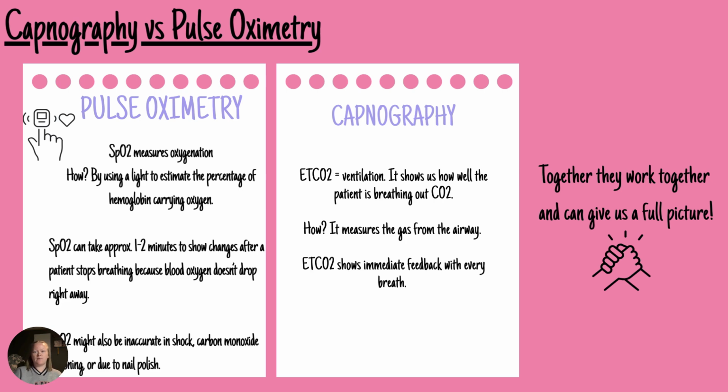So it shows us how well that patient is breathing that CO2 out by measuring the gas from the airway. This shows us immediate feedback with every breath. So we work them together and they show us the full picture of what's happening.